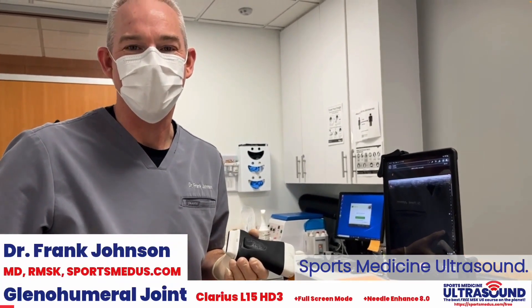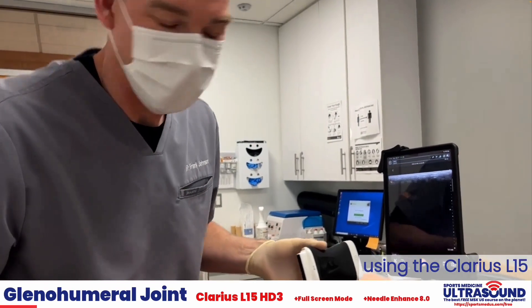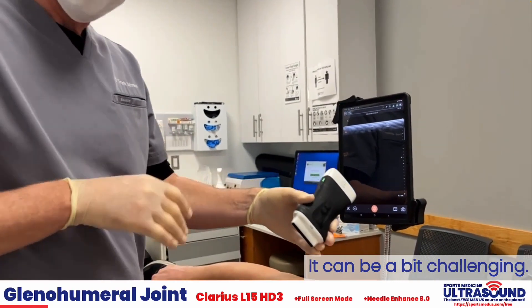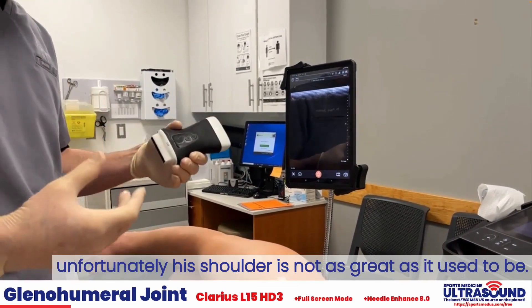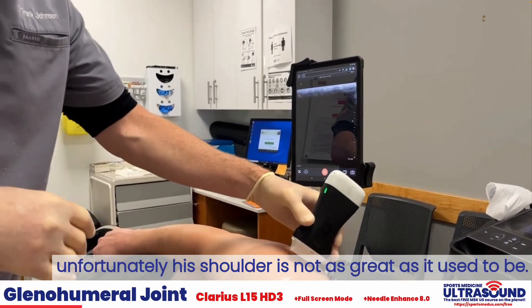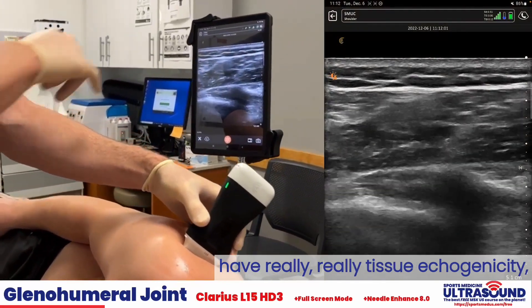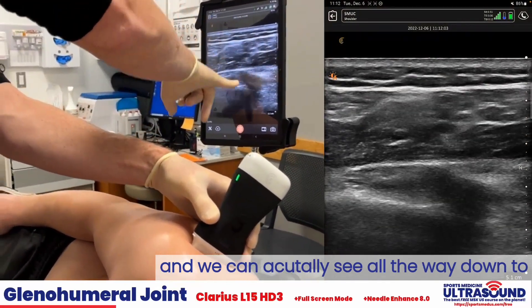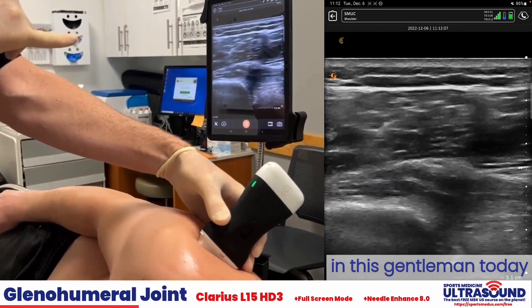Dr. Frank Johnson from Sports Medicine Ultrasound here to demonstrate glenohumeral joint injection using the Claris L15. It can be a bit challenging. Luckily my patient today is a young healthy man. His shoulder is not as great as it used to be, but younger healthier patients have really good tissue echogenicity and we can actually see all the way down to the glenohumeral joint quite well from this gentleman today.